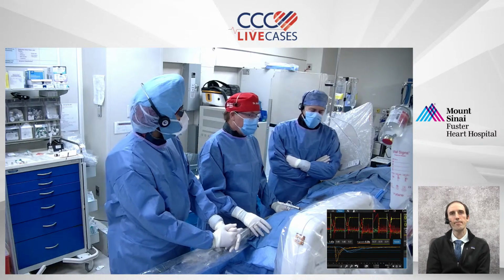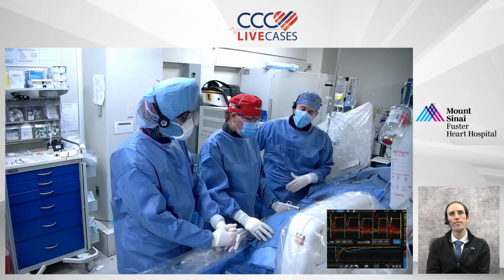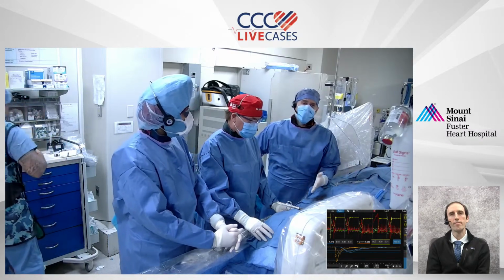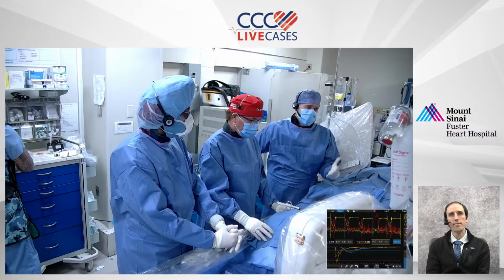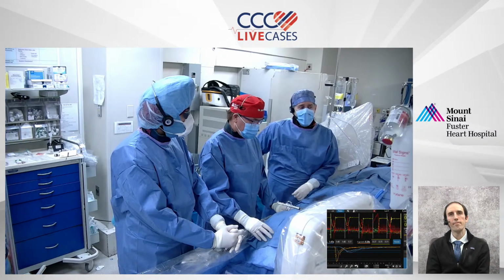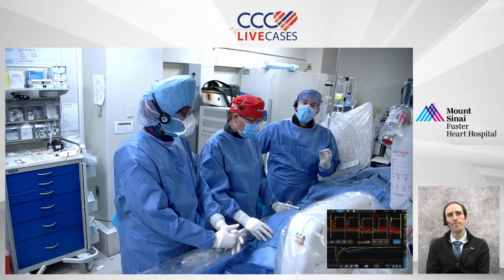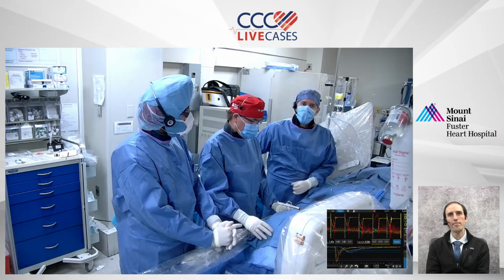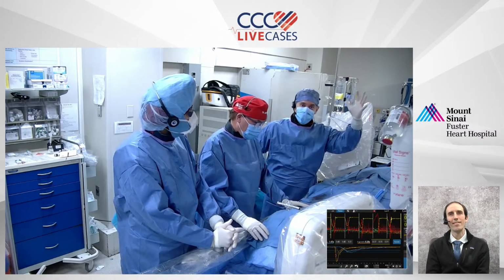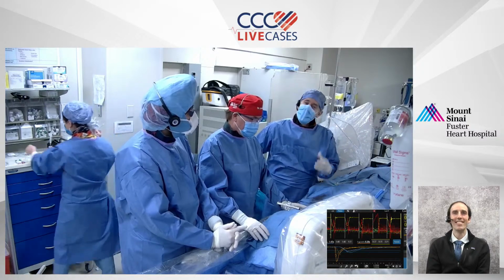I think the way I talk to patients after this is I have a long process of sitting down with the patient before this, and I describe exactly what I'm doing, the risks associated with it, but more importantly, what the findings are going to tell us. And I think having that discussion before is very, very helpful, because what I found is most patients understand this. I give the example of a tree, with the leaves and the branches, the epicardial vessels and the microvascular vessels being the leaves, and they get it.